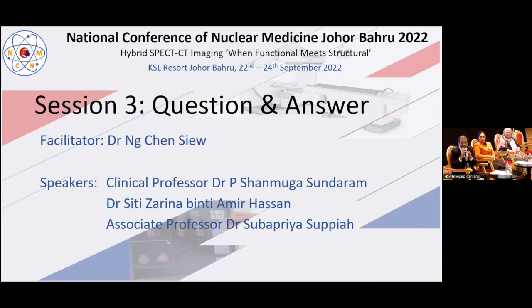And in a subtraction scan, patient compliance is also very important. You have to make the patient lie down for 10 minutes after the injection, or 15 minutes after the injection of pertechnetate. Then after the imaging, you are injecting sestamibi. Again, you must wait for 10 minutes. You should not start the imaging immediately. So, 10 minutes, then the initial image. In total, more than 30 minutes the patient has to lie down without any motion. So let that difficulty of lying down be reserved for those 10%.